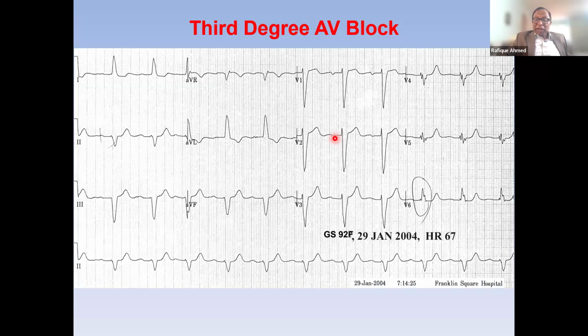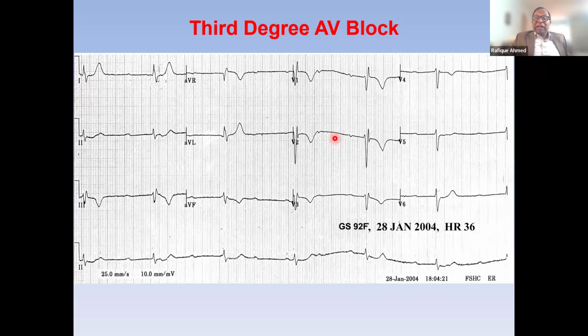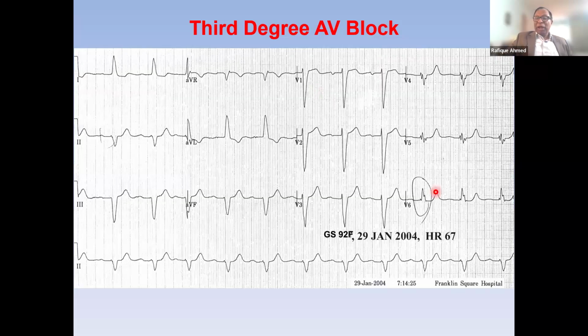Her ECG next day was left bundle. That's where I will rush into doing a pacemaker. Again, we try not to put in a temporary pacemaker, but if you do so, I won't blame you.